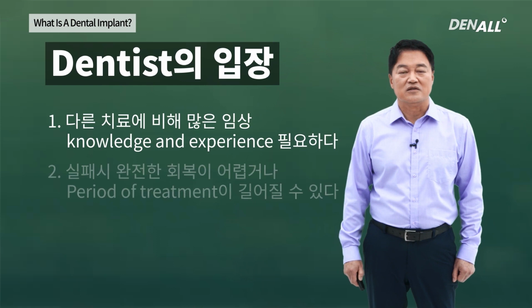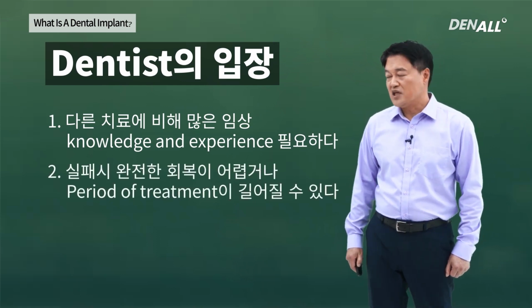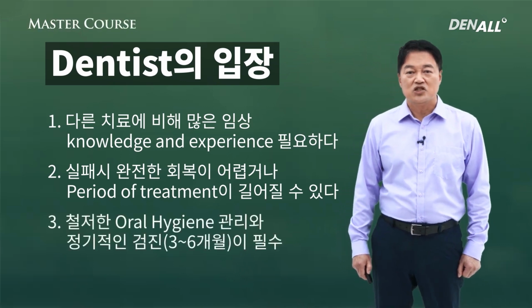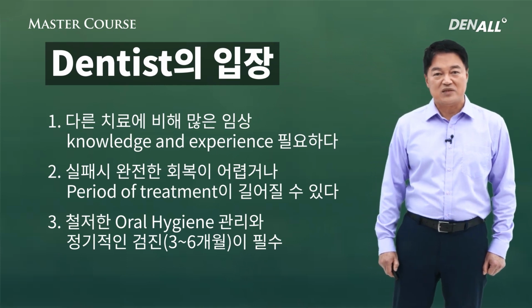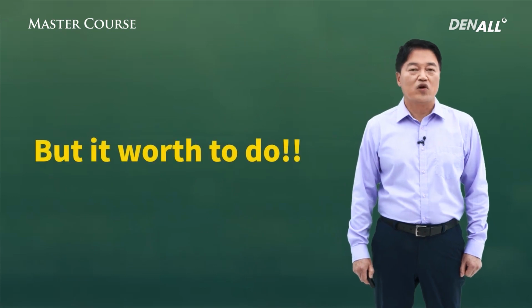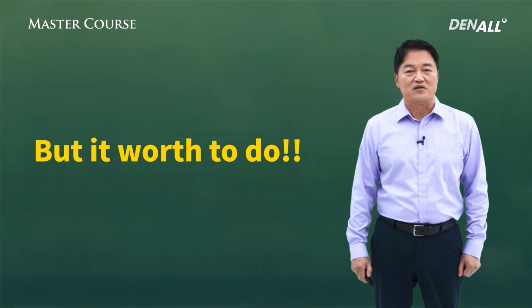Second, if it fails, it is difficult to achieve full recovery or the period of treatment can become elongated. Thorough oral hygiene and regular checkup is also essential. However, implant has many advantages and it can overcome such disadvantages.